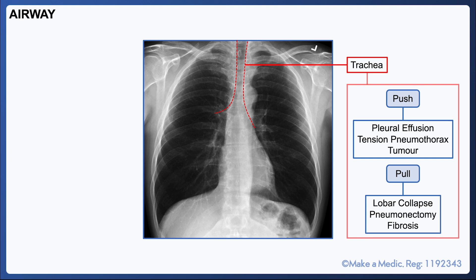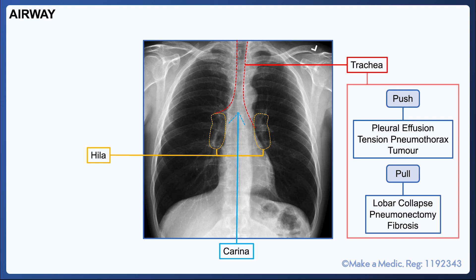You should also note the location of the carina. This is particularly important in patients who have had an NG tube inserted, as the tube should bisect the carina and the diaphragm. Finally, the hila are the roots of the lungs that consist of pulmonary vessels and the bronchi. They may look particularly prominent in patients with hilar lymphadenopathy.